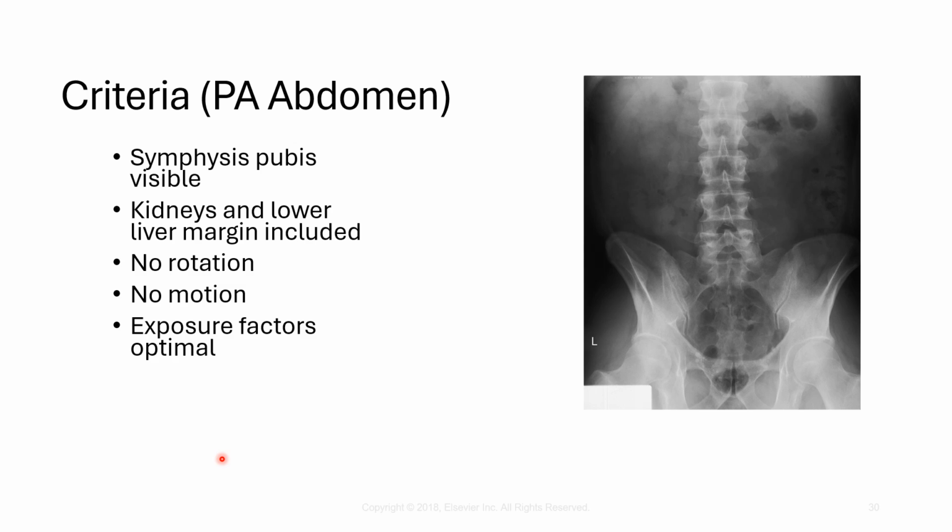They'd rather have an AP abdomen, but if warranted, then this would be acceptable to do. But like I said, most of the time we're not doing one image. Minimally, we're doing a T-shot, or we're going to do 2 IRs placed landscape with a minimum of 1 to 2 inches of overlap on the patient.